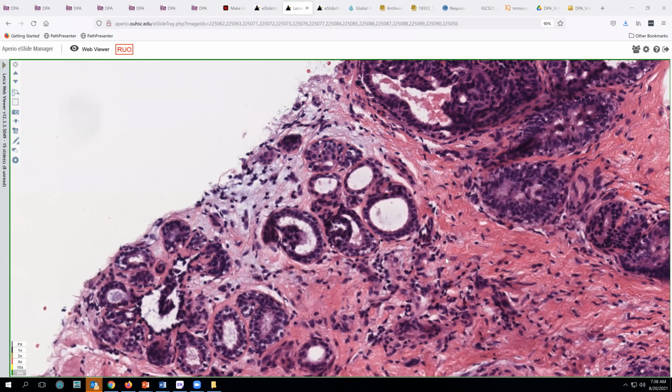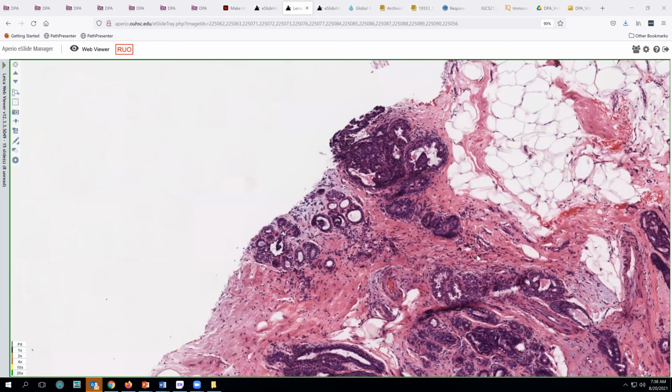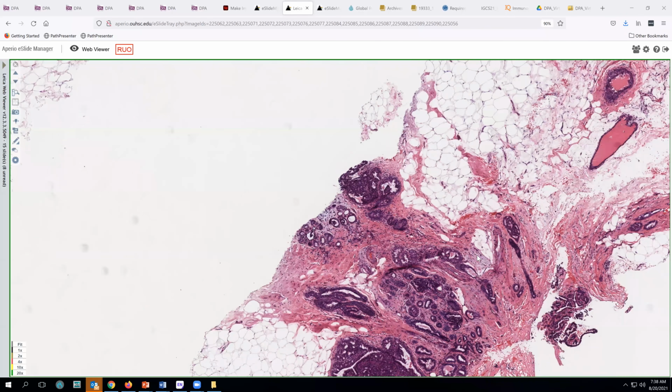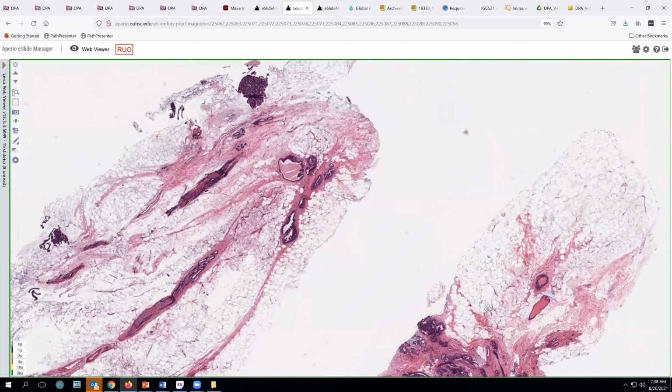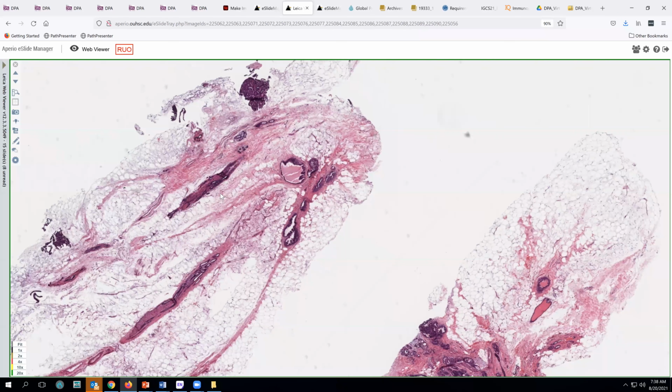If we've got cancer in it, or if we need to evaluate for potentially invasion or something like that, we can use a P63 on a nearby section without having wasted tissue or lost the diagnostic material. So cutting multiple levels on these breast biopsies, saving intervening levels for possible immunohistochemistry is a good practice to follow in your laboratory.